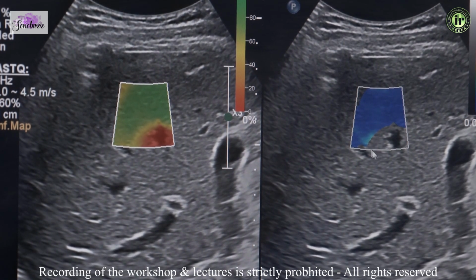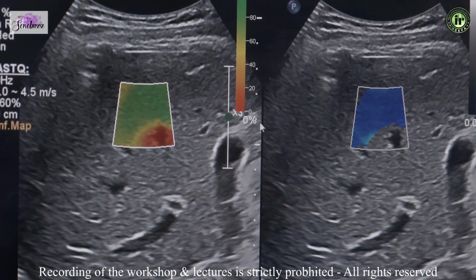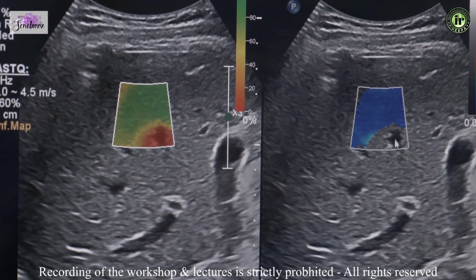And if you look at this image on the right hand side of the screen, you can see that this is actually not filled up with the color. Whereas on the other hand, the area which is blue and which has filled up with color very nicely, you can see is actually reflecting as green. So even if this vessel pops up over here, like it has come in this particular image, you can see that it's getting reflected as red on this screen. So you know that this is an area where you do not want to take your measurement.